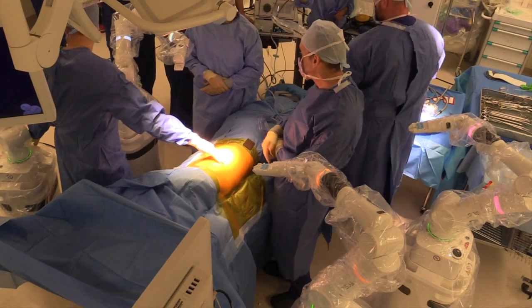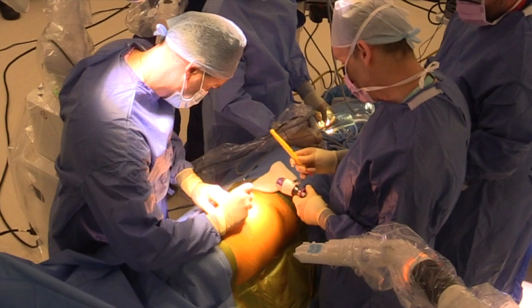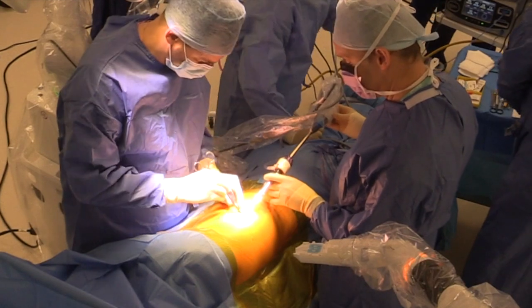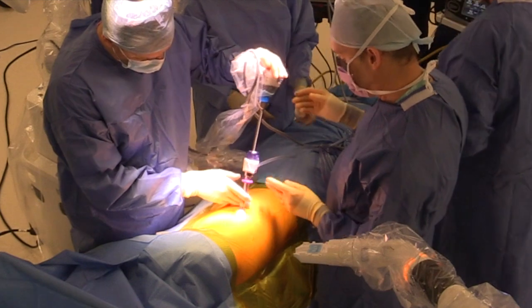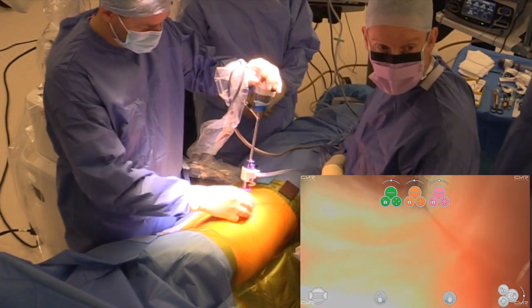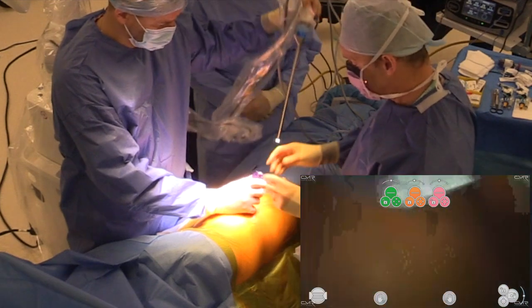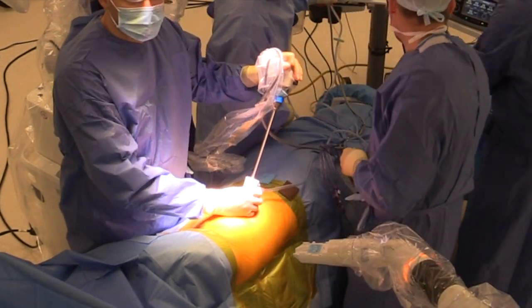Adam is ready to do the incisions. It really just takes five minutes — they all get pre-draped and we're getting them to the correct height. We're going to do our ports, very similar to all other robotic techniques with Versus. The camera goes right at the highest point, about the eighth space. This is the most important one: we do a direct entry technique where we watch the camera go in, which keeps a really small incision and a good CO2 seal. You can see adhesions, and we've got a direct entry port.